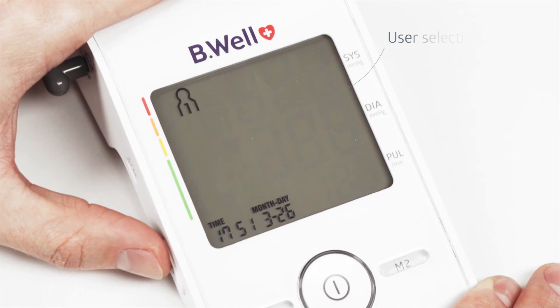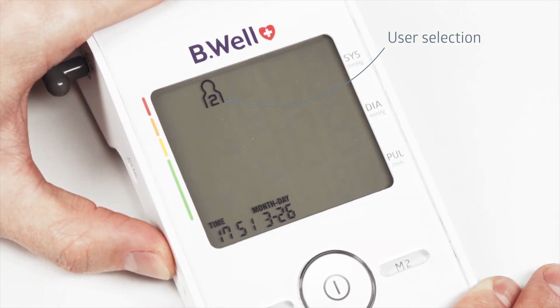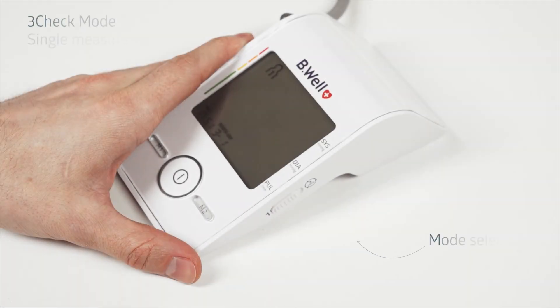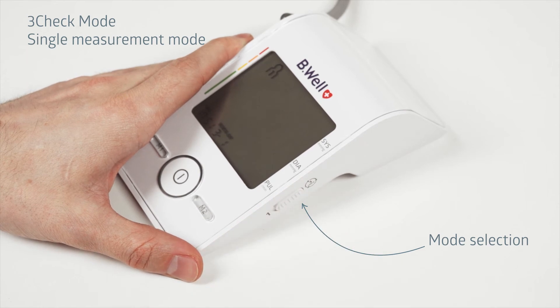The Med55 tonometer is convenient for family use. The device has a 60-measurement memory for two users. Select user one or two using the time button. Med55 has two measurement modes: standard single measurement and three-check mode. The convenient mode can be selected using the switch on the right side of the device.